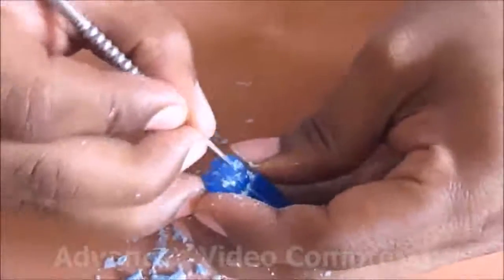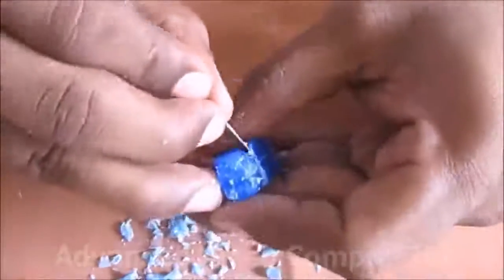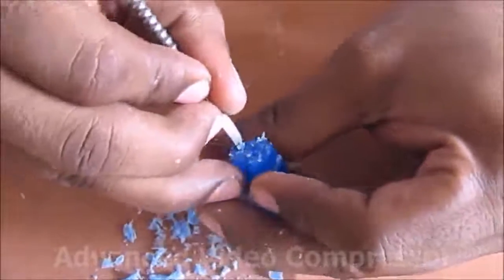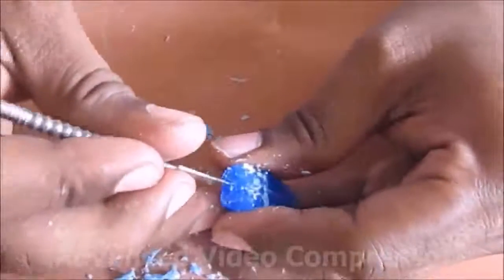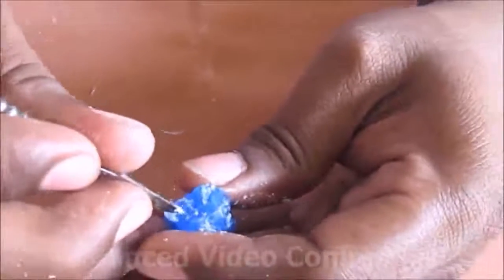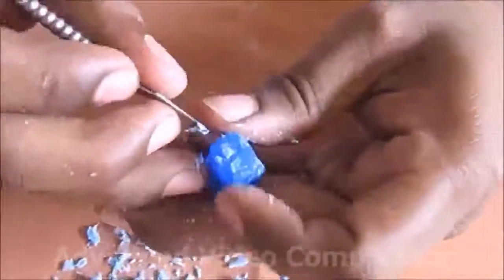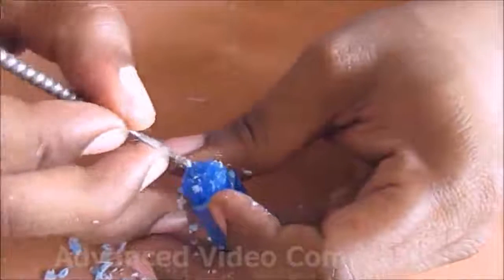An important but cumbersome task is making the triangular fossas. I try and accomplish this by emphasizing all the other slopes and ridges around it. I take a point approximately 1 mm away from the marginal ridge and proceed to deepen the point. You can also imagine this deepest proximal point as the apex of a pyramid and the marginal ridge and cusp slopes as its three sides.